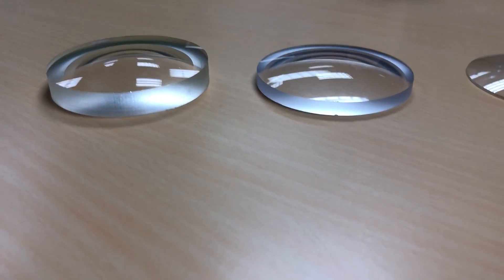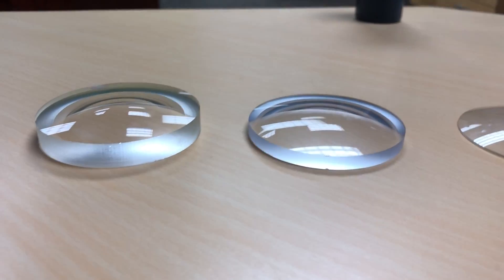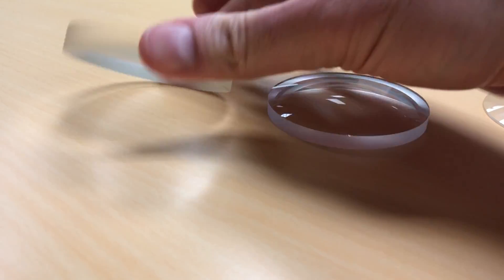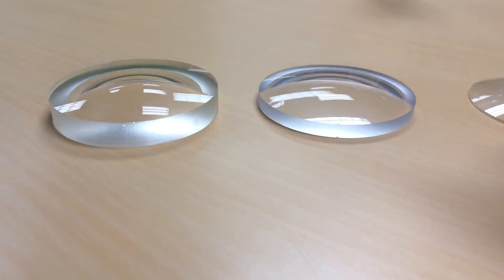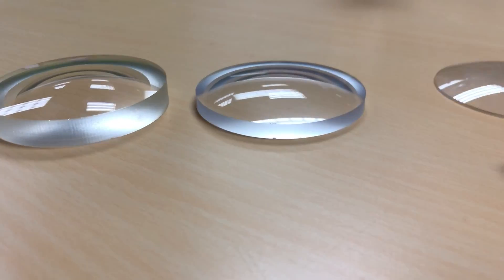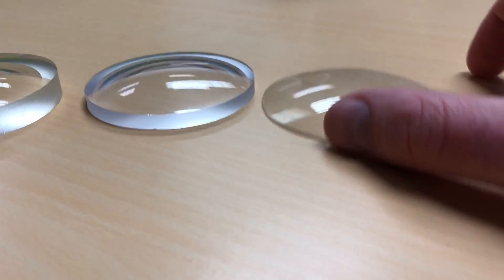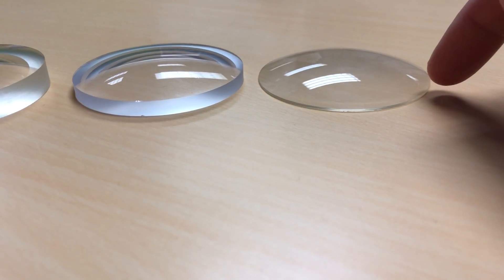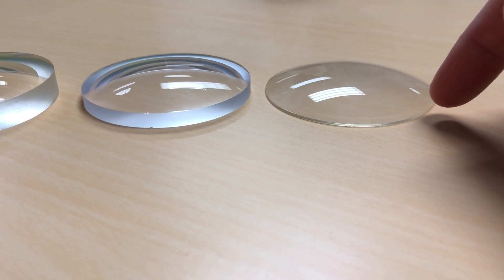The one on the left is a minus six lens. You can see it's very thick on the edge and thinner in the middle, which is a concave shape. This is a minus three, so less thick but still a concave. This is a plus three, and you're gonna see that it's thinner on the edge and thicker in the middle.